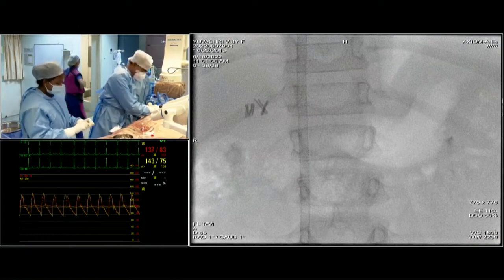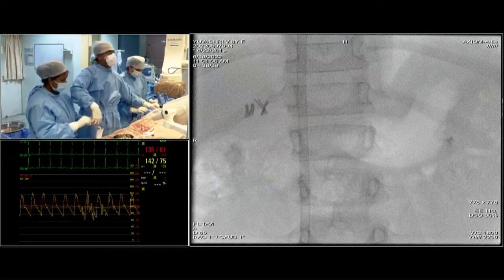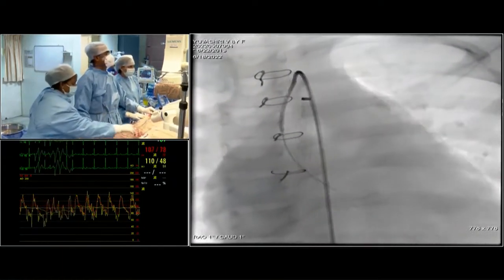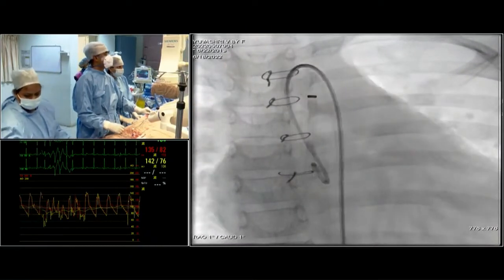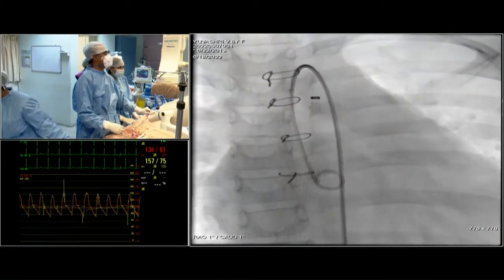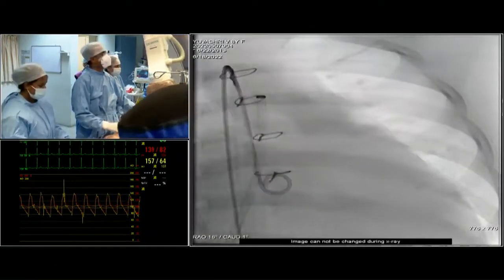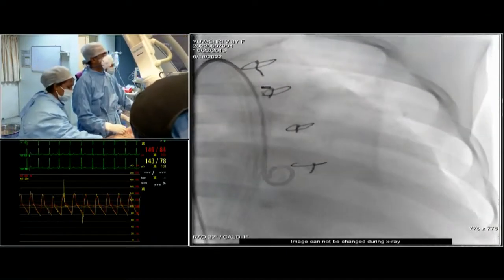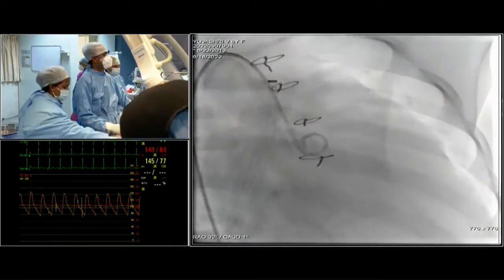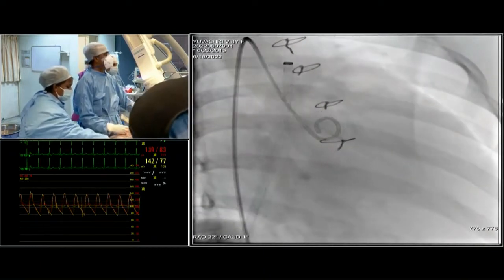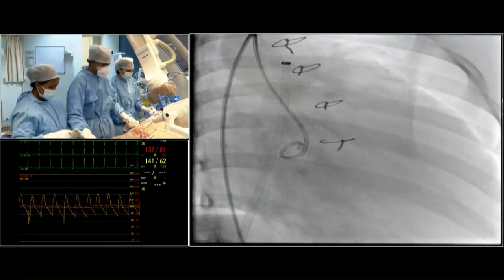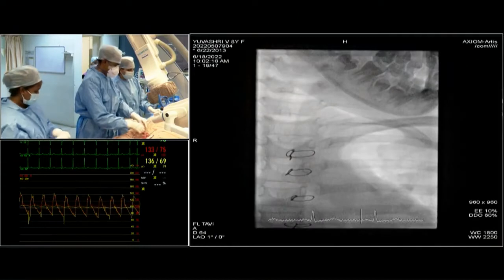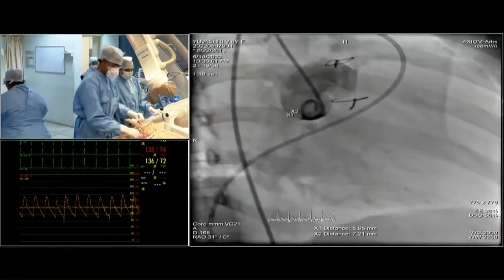Now I will advance the wire and return to the RAO projection, keeping the catheter in the same sinus. A frequently asked question about RSOV closures is whether the coronaries are at risk — they are never a problem in congenital RSOV because anatomically they are located elsewhere, at the upper end of the sinotubular junction.